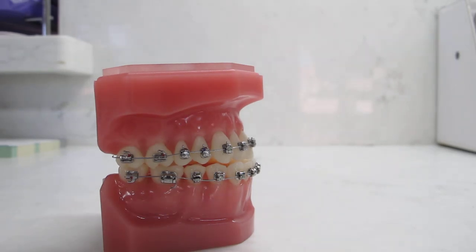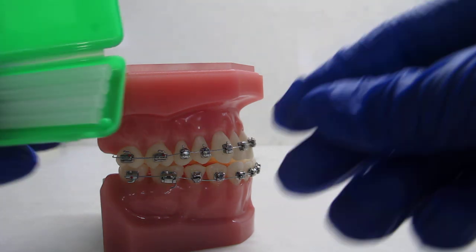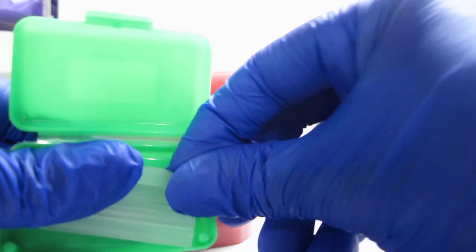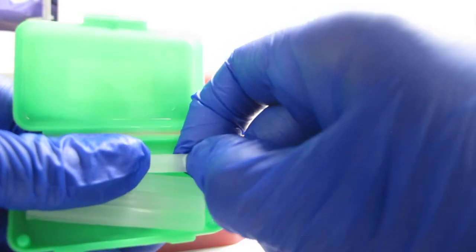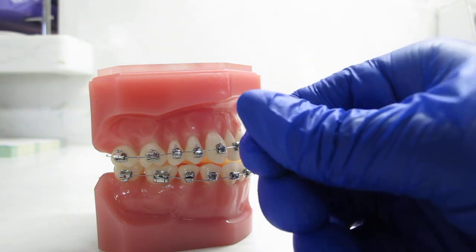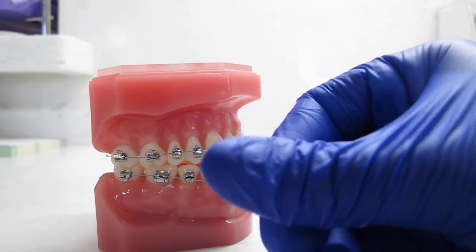How to use orthodontic wax. Take the wax that was provided, pinch a small piece off, and roll it between your fingers to warm it up.